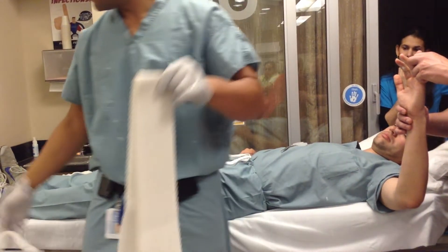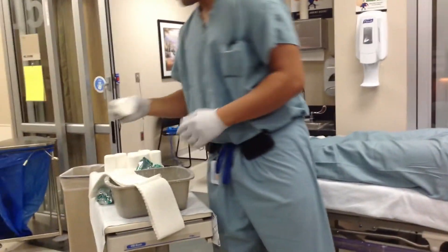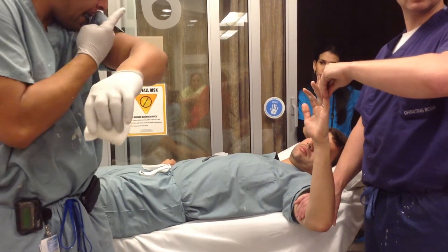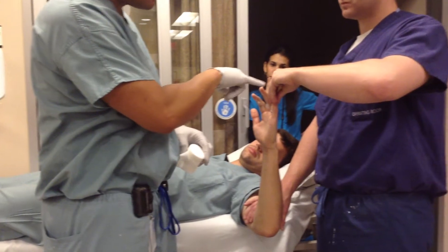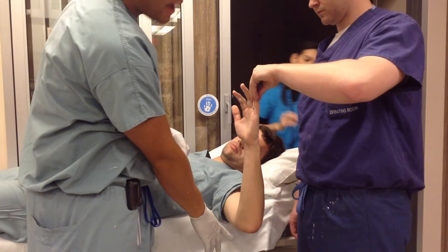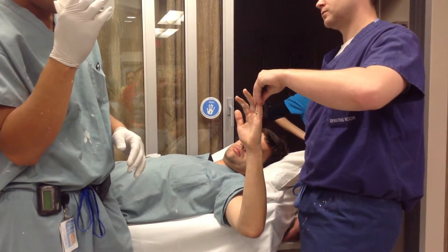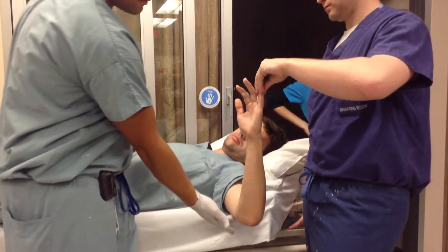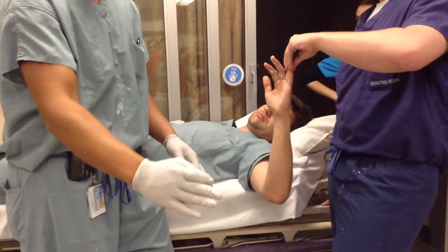I'll call that seven. What are your measuring points on that, similar to before? For this, it really doesn't matter too much. I just want to make sure it's coming out to the end of the fingertips, and then I do mine to back here. This is one of those things where you could stop this short here. If you do it back here, you need to make sure that you pad them up quite a bit back there, because they're going to want to move.